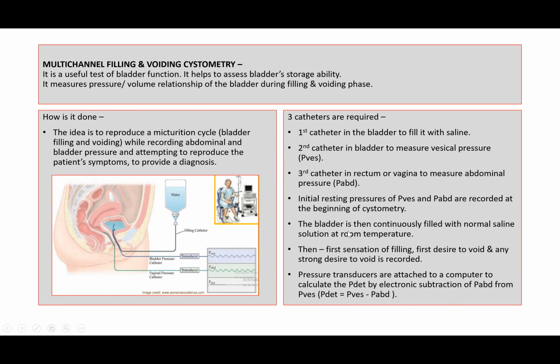After that, the bladder is filled with normal saline. Then in the filling phase, we have to record the first sensation of filling, the first desire to void, and any strong desire to void.